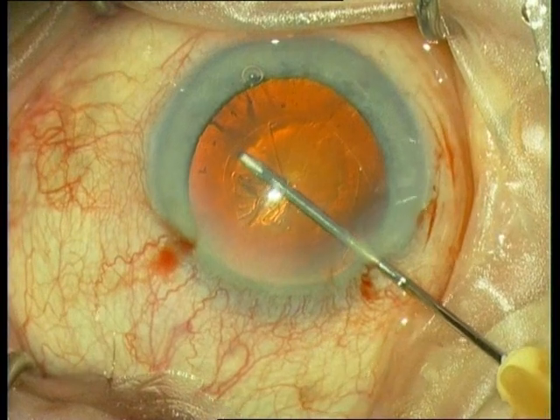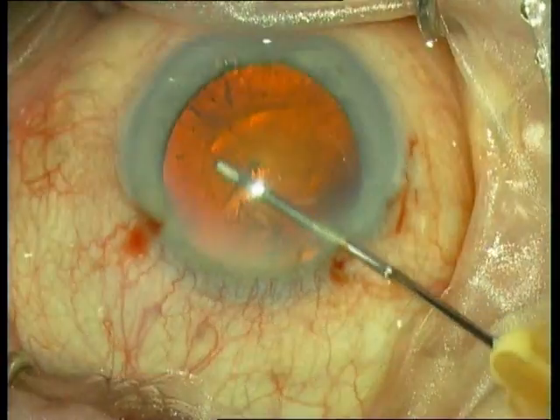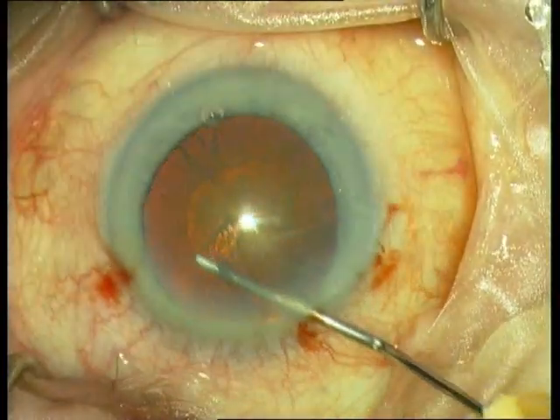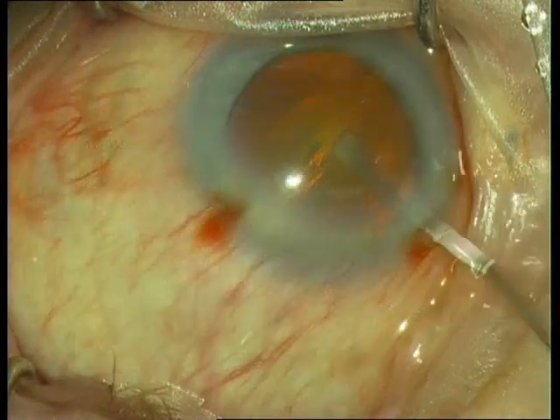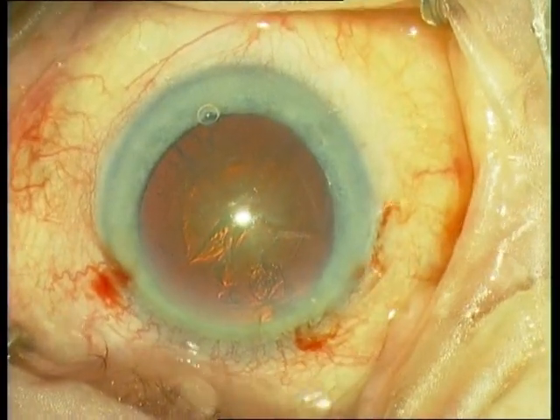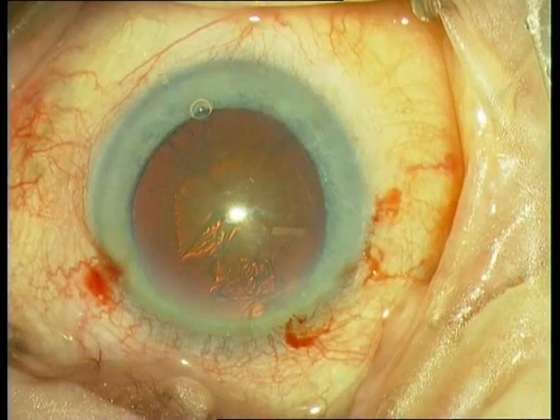The rexis should be not too big and not too small. Very important is that you always complete the rexis. Never leave a rest of the flap, otherwise the phaco tip will suck in the flap and cause a posterior capsular defect.